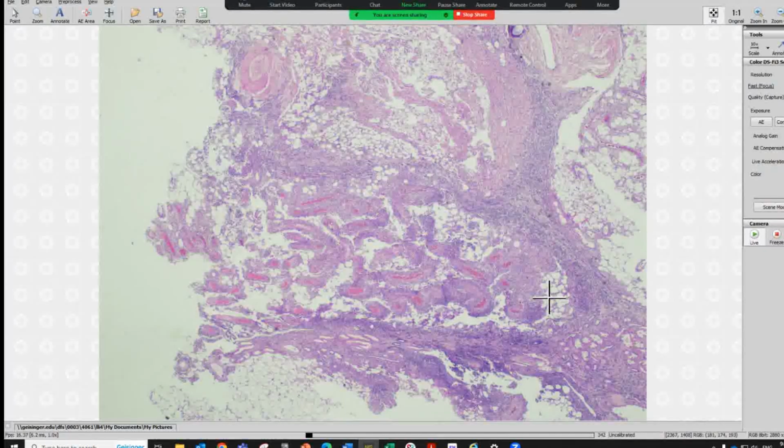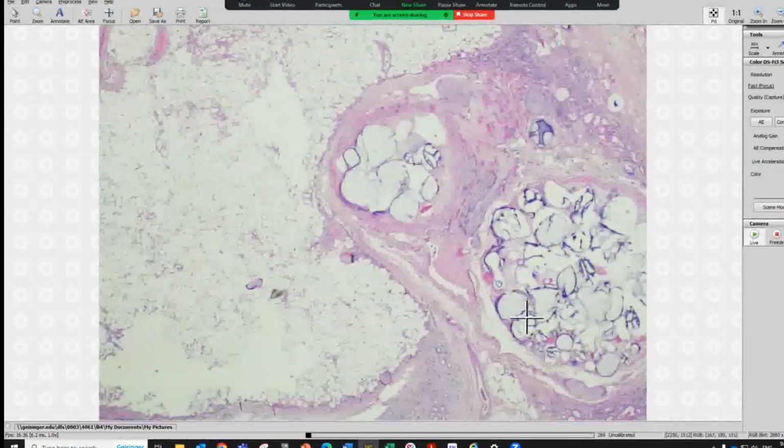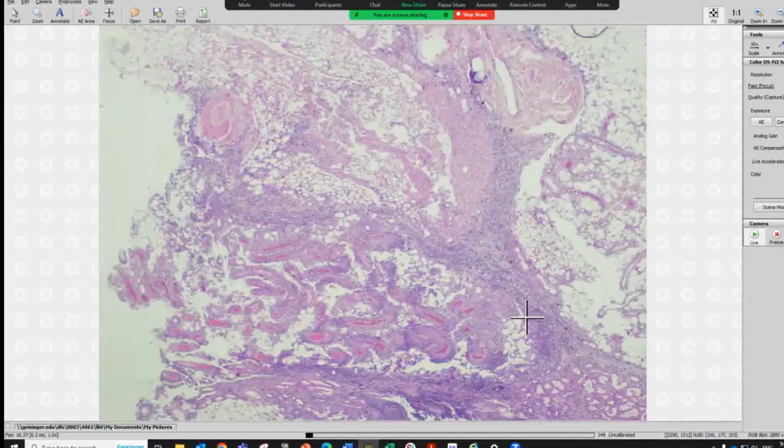This patient had bilateral AML, so this patient has tuberous sclerosis. So the whole story of this patient is really interesting, especially when you didn't know the history and you just see this gel foam here, and then your diagnosis of AML, and then you can guess the whole history of this patient.